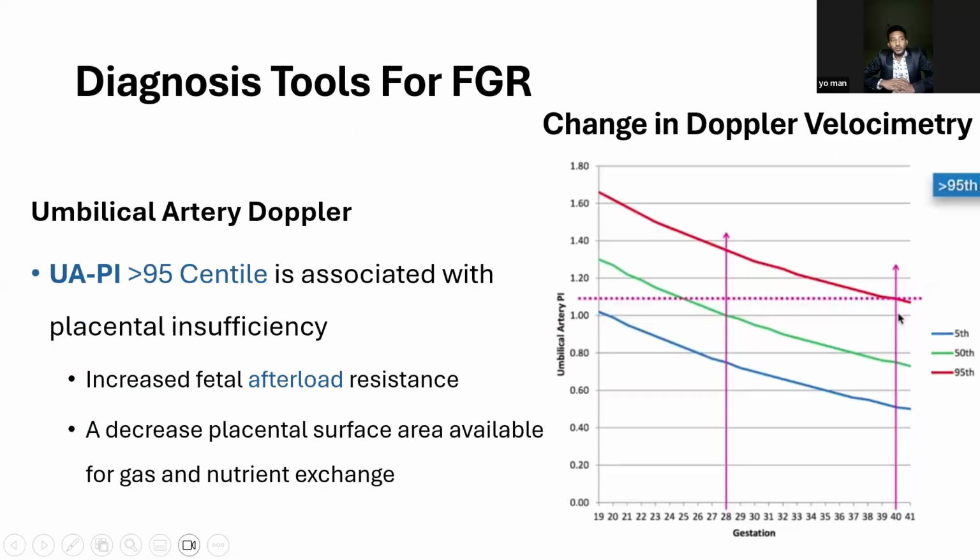That's the qualitative approach, but quantitatively, for the PI, you have to check your graph. After calculating and obtaining the result of the PI, you have to check the centiles of that PI for the established gestational age that we established in the previous slides. What I call pivotal is that it is not only for sizes, it's also used for knowing the centiles of the Doppler indices.